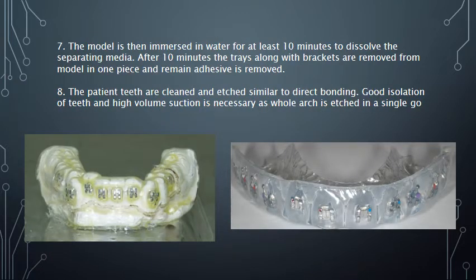The model is then immersed in water for at least 10 minutes to dissolve the separating media. After 10 minutes, the trays along with brackets are removed from the model in one piece and remaining adhesive is removed. The patient's teeth are cleaned and etched similar to direct bonding. Good isolation of teeth and high volume suction are necessary as the whole arch is etched in a single go.